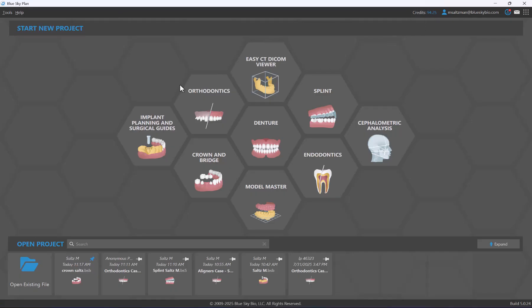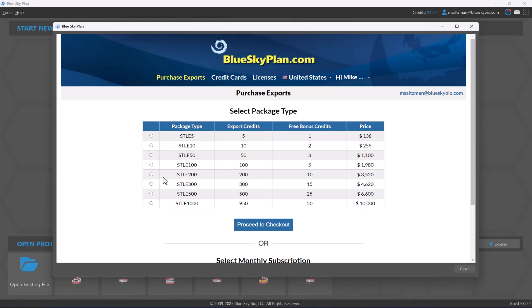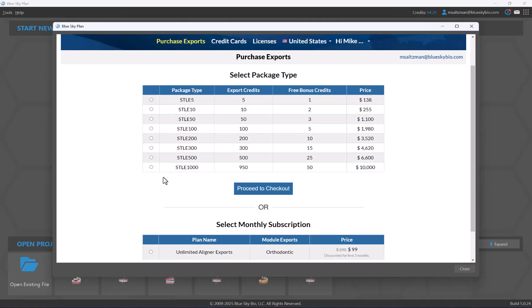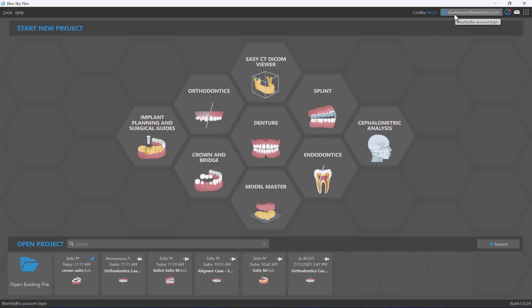Moving across to the right side of the screen, we can see the number of export credits remaining in our account. The export credits are associated with the particular user account. If you click on the number of credits it opens the credit purchase screen, allowing you to purchase export packages or monthly subscriptions.